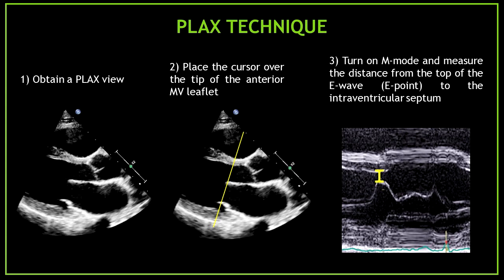Let's review the parasternal long axis technique to obtain the mitral valve E-point septal separation — three easy steps. Number one: obtain a parasternal long axis view. Number two: place the cursor over the tip of the anterior mitral valve leaflet. Number three: turn on M-mode and measure the distance from the top of the E-wave, which is the E-point, to the septum.